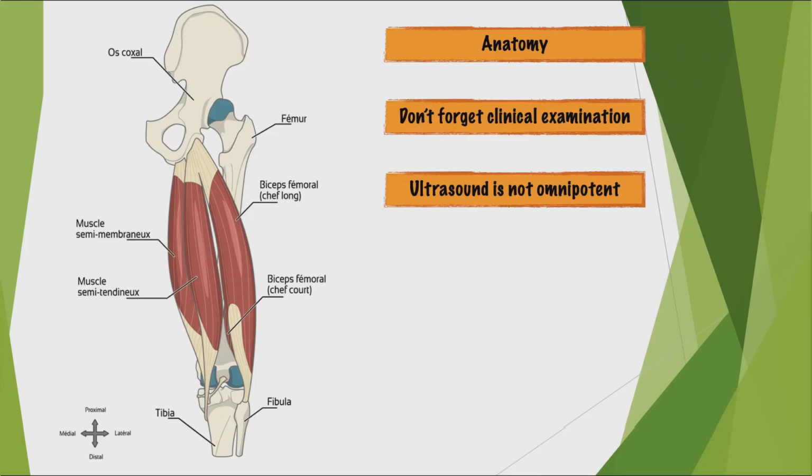Now that's something to keep in mind. You'll have moments when, no matter what you do, you come up short. I'm not saying you won't get out of it at all, but you will have a tough time. And there's no need to get frustrated about it. Ultrasound has its limits because of its physical mechanism. Sometimes ultrasound penetrates poorly, returning with difficulty to the probe, and you'll have difficulty obtaining an image.